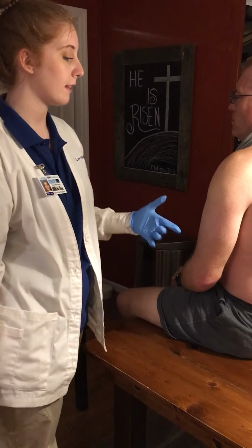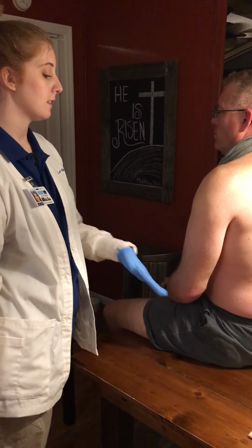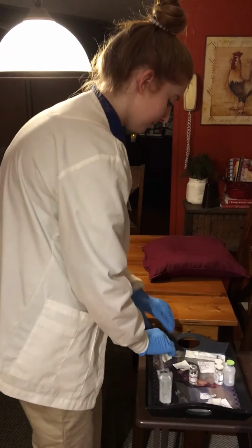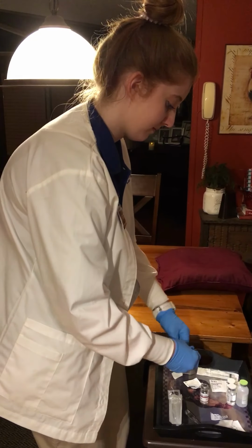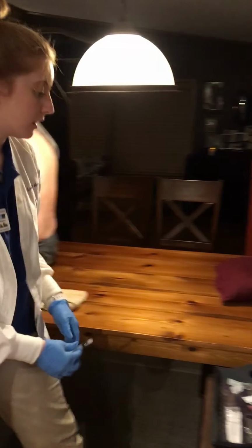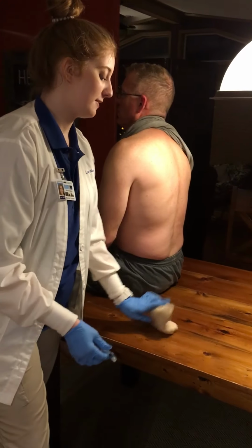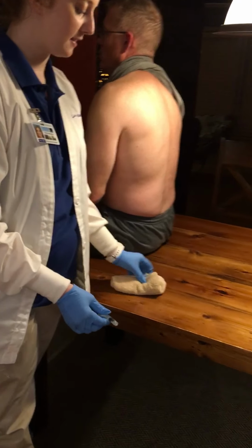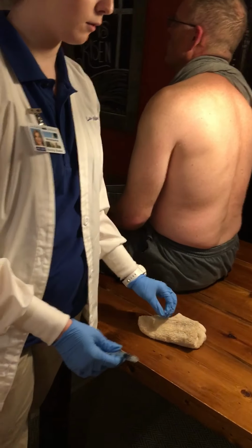And you want to make sure that their arm is relaxed and bent at the elbow also. So I'm going to be using this towel as my patient for this.